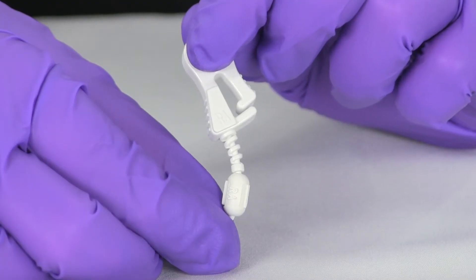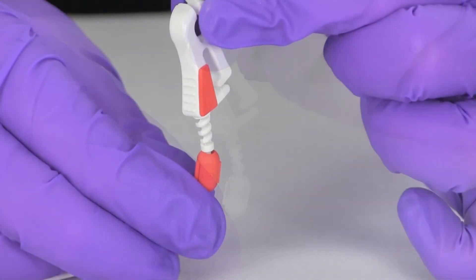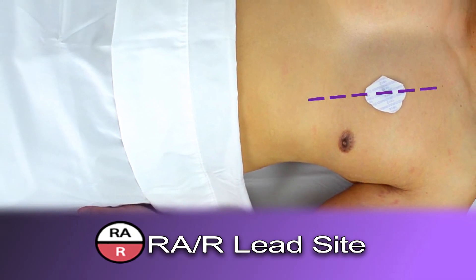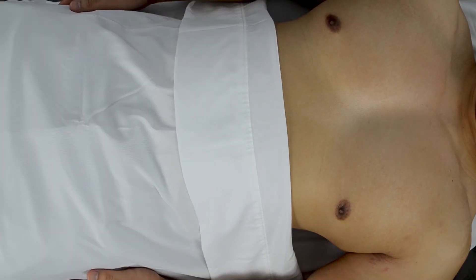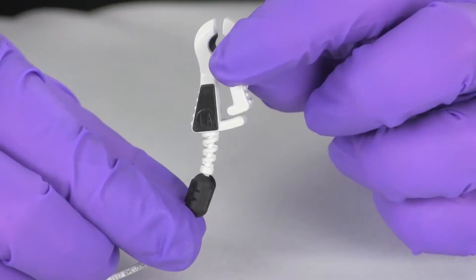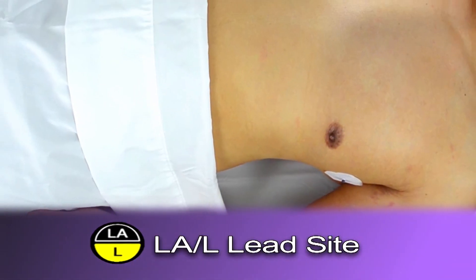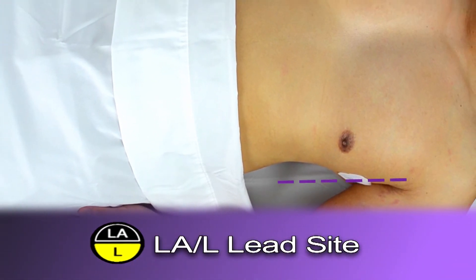The RA or R electrode site targets the intersection of the heart and anterior median line. If anatomy permits, the ideal location is about 2.5 centimeters or one inch to the patient's left of the anterior median line, which minimizes any patient respiration artifact. Respiration motion can cause a variation in the QRS amplitude, which can be undesirable for certain MRI applications such as cardiac gating. The LA or L electrode site is placed on the intersection of the heart and the anterior axillary line when the patient's anatomy permits. Avoid placing the electrode directly on top of dense breast tissue as this will cause an artifact for ECG signal.